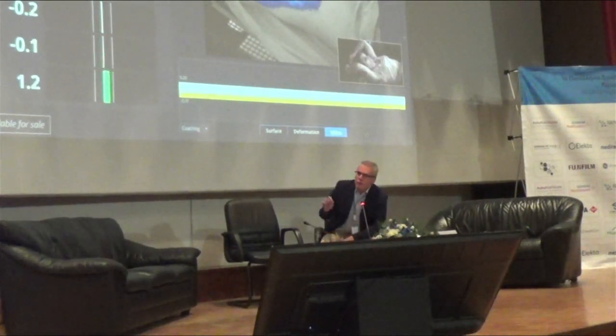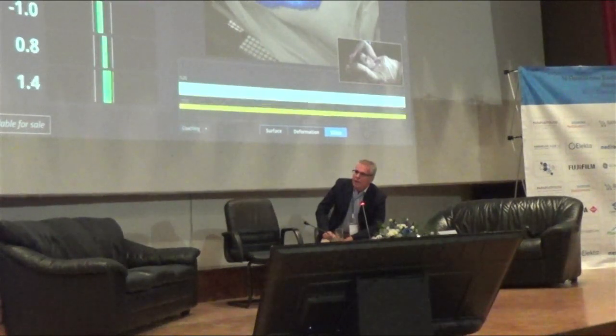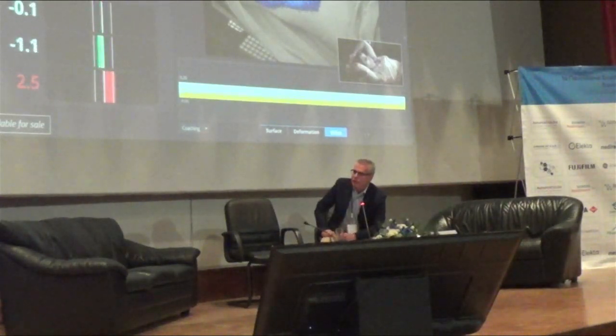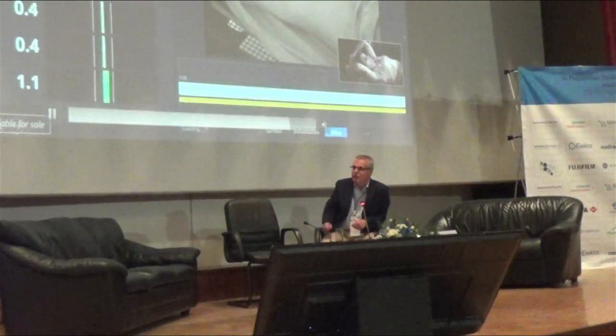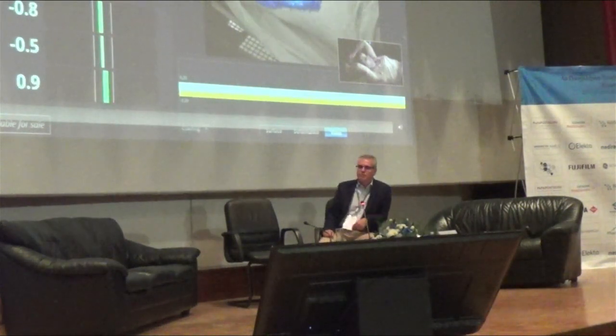I would like to insist on a point which has been mentioned in many publications. It's about the implementation of SGRT in SBRT treatments, especially when motion management is required. There's a lot of discussion whether the patient's outer surface may represent the internal target motion. Since you are here, we would like you to share your experience with us about the suitability of SGRT in monitoring this target motion. Yeah, so that, of course, is site dependent.